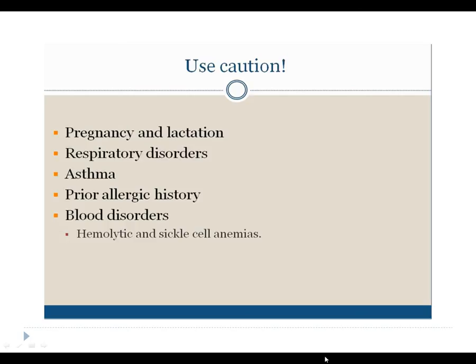There are several situations where we should use caution before giving MR contrast. They include pregnancy and lactation, patients with any respiratory disorders, asthma, or any prior allergic history to IV contrast materials, and patients with any blood disorders such as hemolytic and sickle cell anemias.